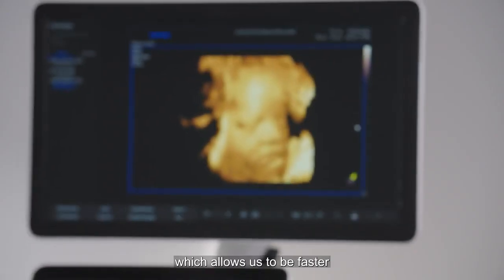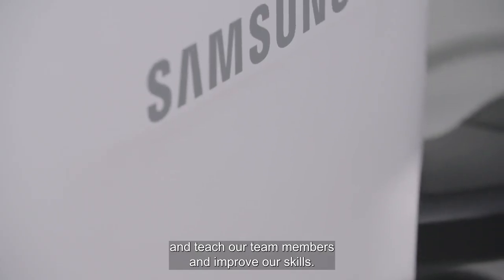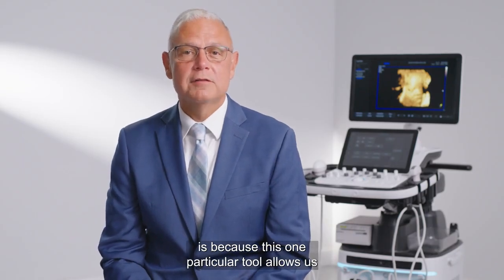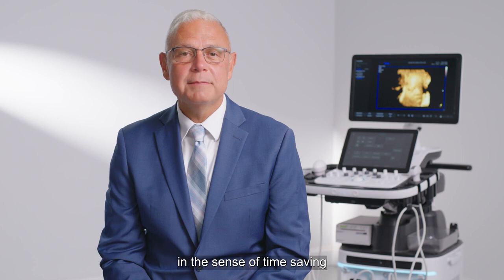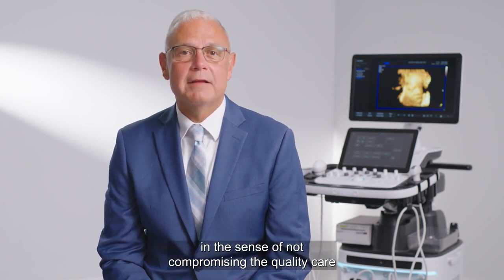intelligence, which allows us to be faster and teach our team members and improve our skills. That's probably the most exciting part for me, because this one particular tool allows us to do multiple things in the sense of education, in the sense of time saving, in the sense of not compromising the quality care that we provide for our patients.